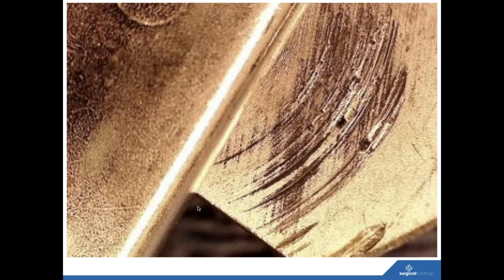Yeah, I mean, this is generally known as fretting, or the start of fretting corrosion. But you're better off, in my opinion, using something like a pen lubricant applicator that you can really get in there and target the key areas of the device, rather than just washing it all over the device, which might cause other issues, far beyond just the localized corrosion that can be avoided by doing so.